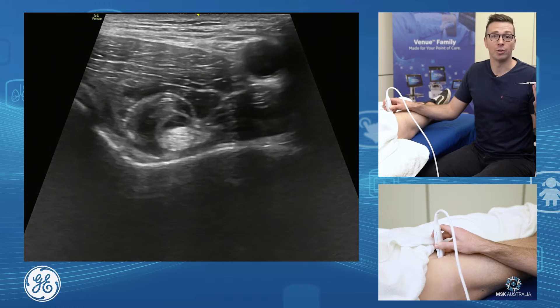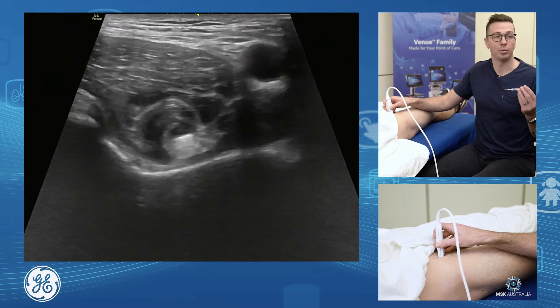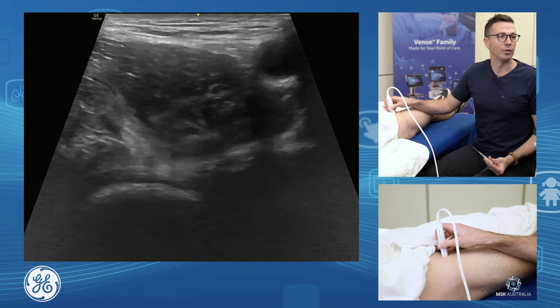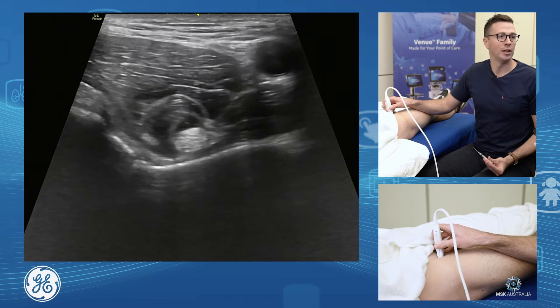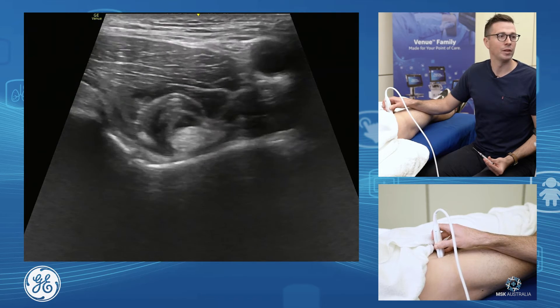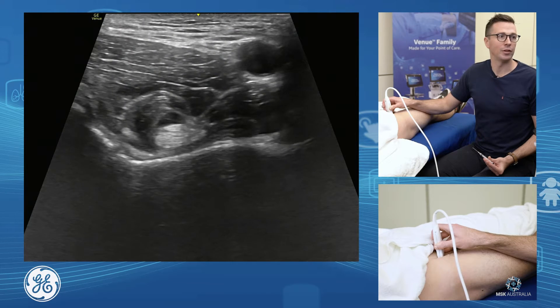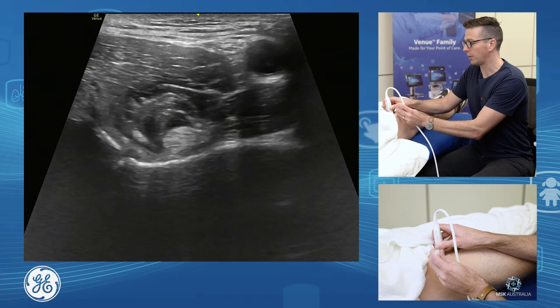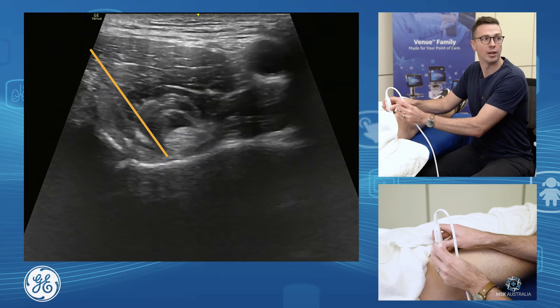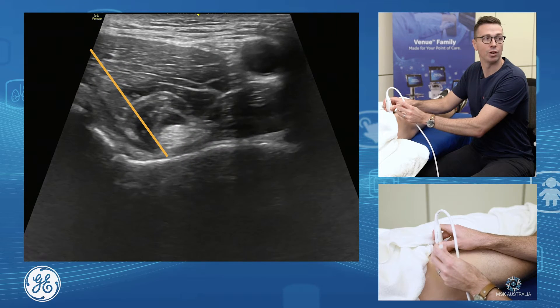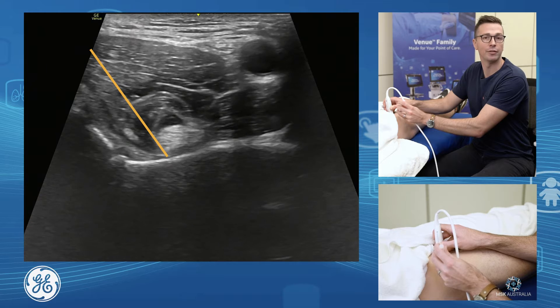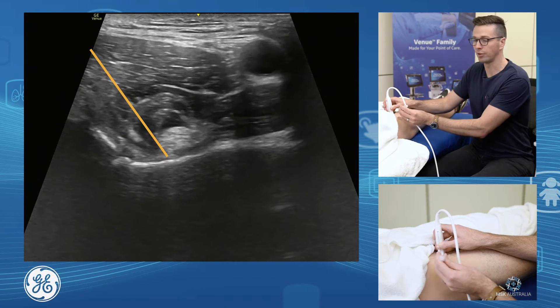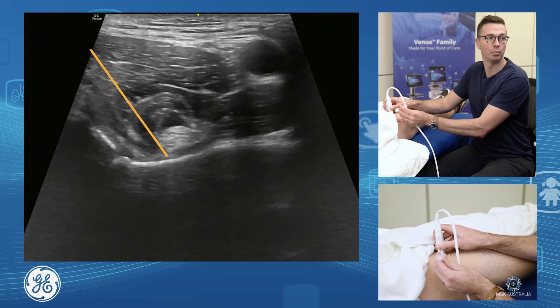If we were to do an iliopsoas bursal injection, this is the approach we would use. Find your iliopsoas tendon sitting at the top — find your femoral head, acetabulum, line yourself up, fix your anisotropy, and bring your needle in at about a 45-degree angle laterally. Slip down to hit the top of the acetabulum, slipping underneath the tendon and onto the acetabulum to perform your iliopsoas bursal injection.